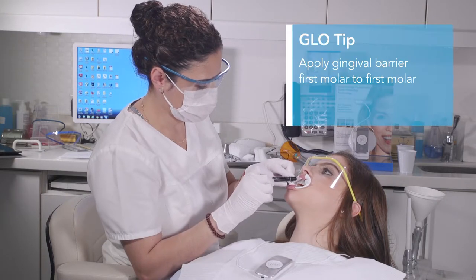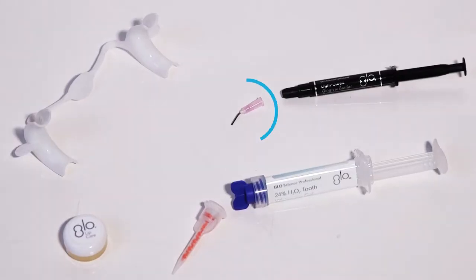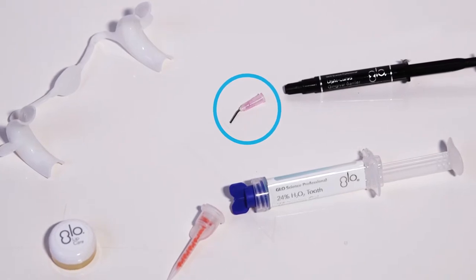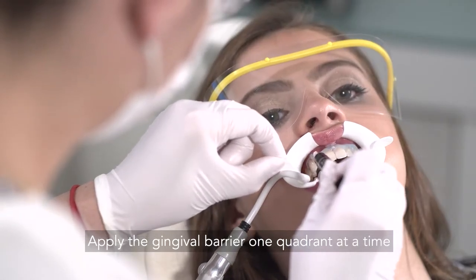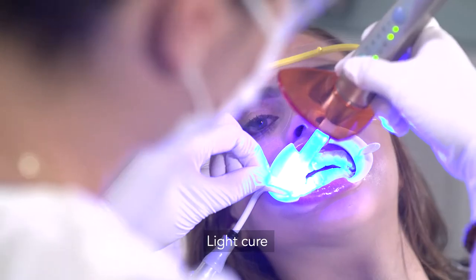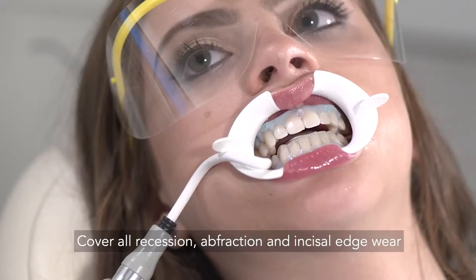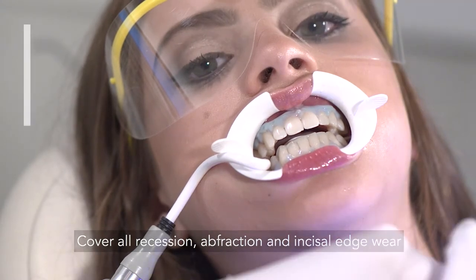Precise gingival barrier application is critical for success. We have included a special tip for applying the gingival barrier in your treatment kit. Insert the saliva ejector and apply the barrier by scalloping the gingival margin — there should be no pink showing. Do one quadrant at a time, light curing after each segment. Make sure to cover all recession, abfraction, and incisal edge wear with the gingival barrier.